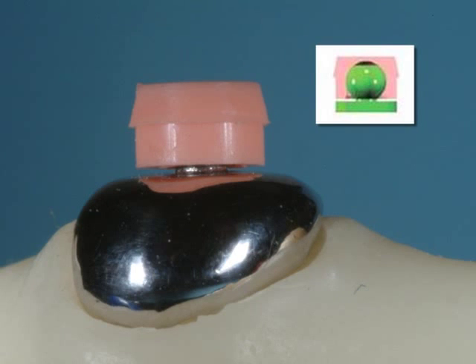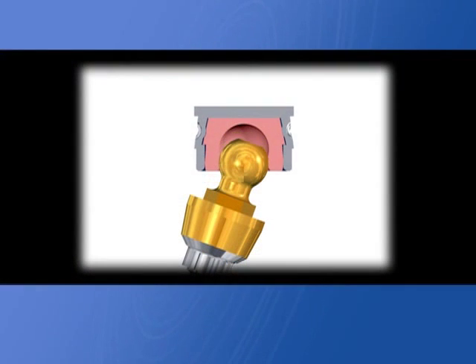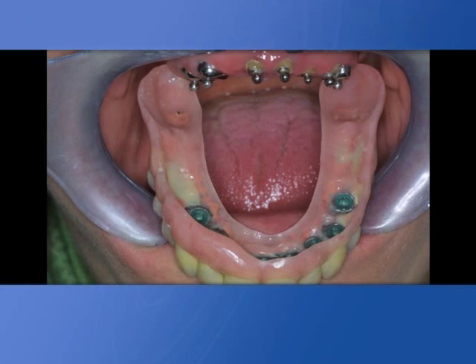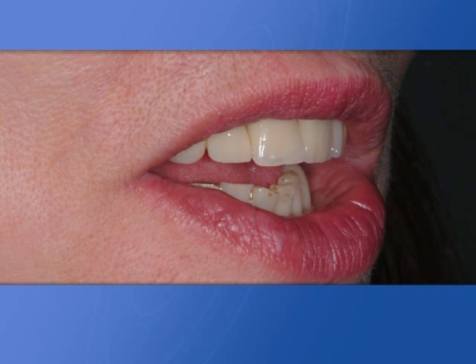Following the suggestions provided in this very easy lab procedure, you will obtain the following results. A. Longer life of the retentive caps. B. Reduced stress on main abutments. C. Denture stability and patient satisfaction.